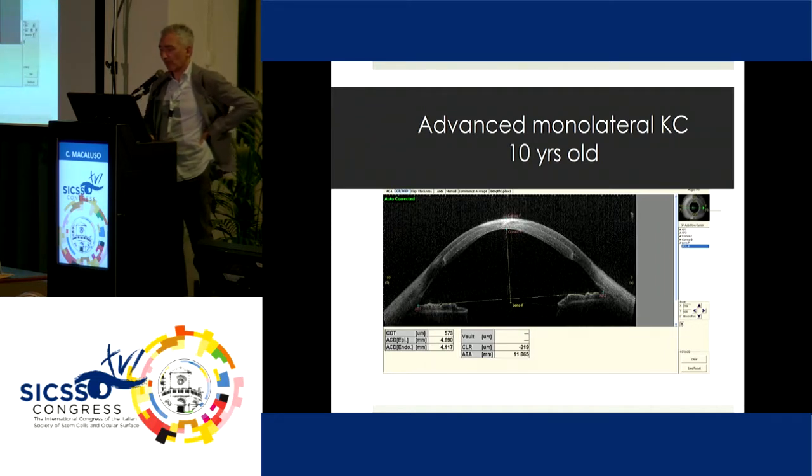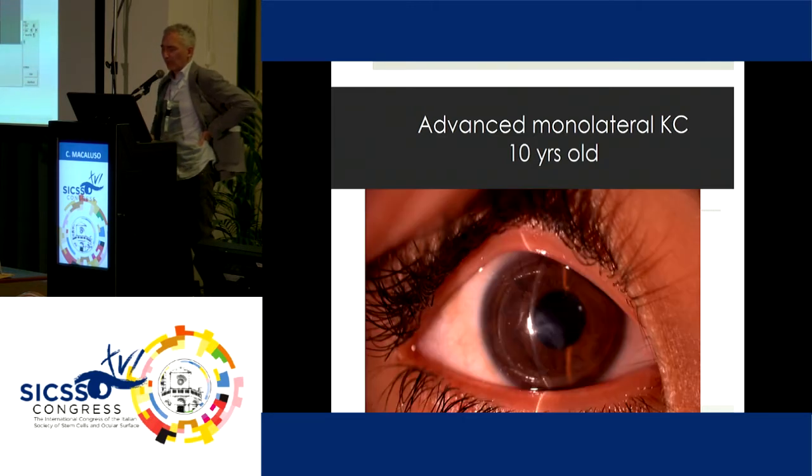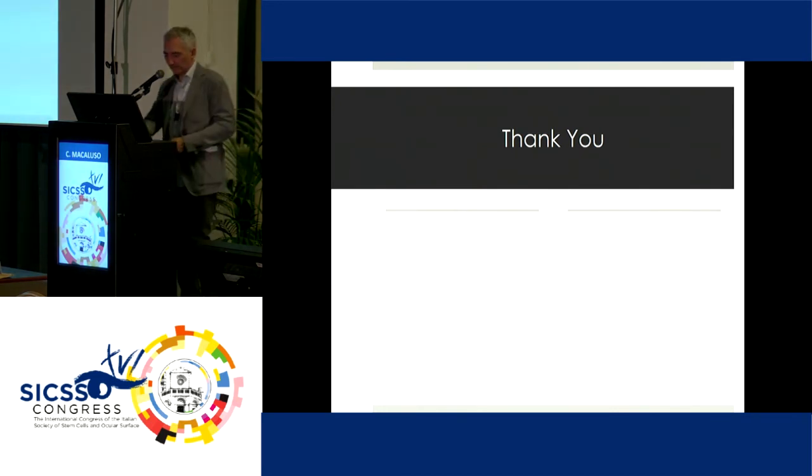This is a 10 years old little boy, an advanced keratoconus. Here I was frightened because the fear was that in playing soccer, for instance, the boy might be traumatized and then the eye might open. And so here I've only put one stitch on the top just for safety reasons. The little boy the following day resumed playing, so he sees 2 of 10. He's only 10 years old, so there is a risk of amblyopia.